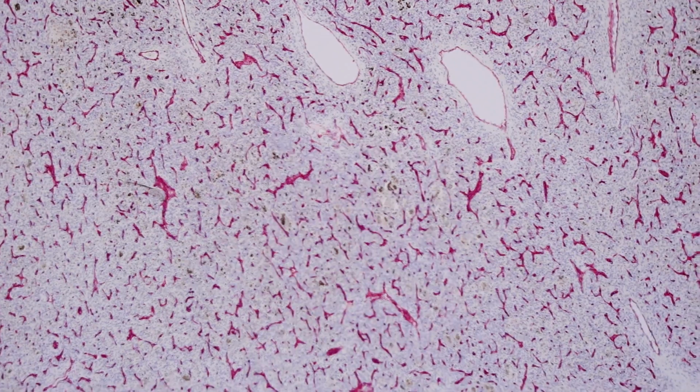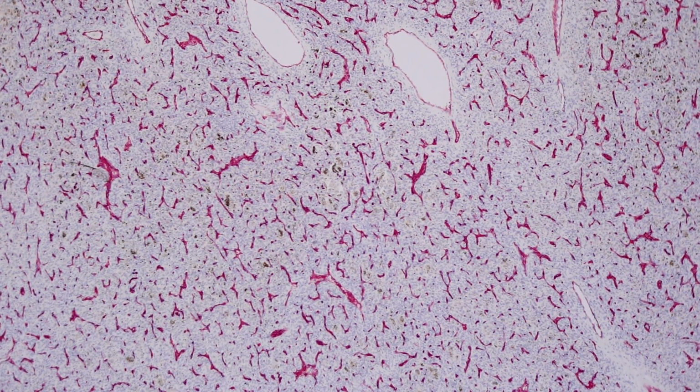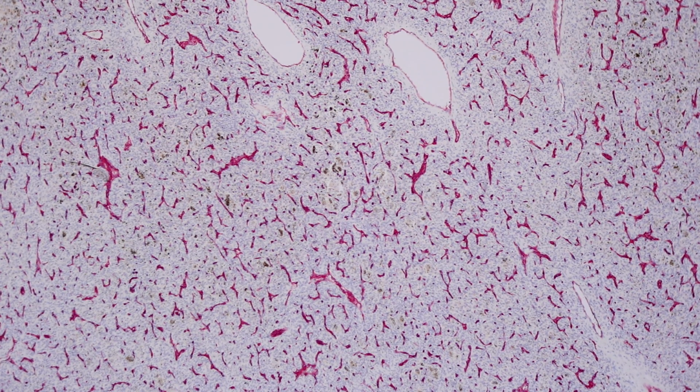But the middle of the lesion should be completely negative, and so if I have that really bright halo on a CD34, you can look to the middle and see, oh, it's negative. And most of the time I don't use immunostains for dermatofibromas or DFSP. In most cases, you can easily separate them on H&E. There are exceptions, particularly when you have a small partial biopsy where you're not seeing the peripheral edges or the deep aspect of the tumor.